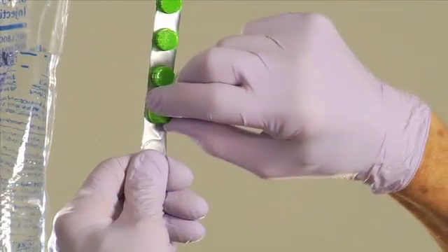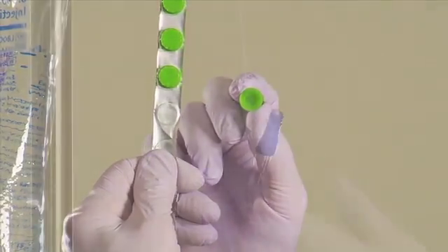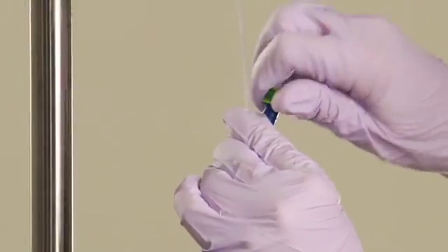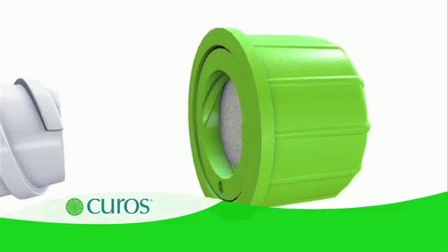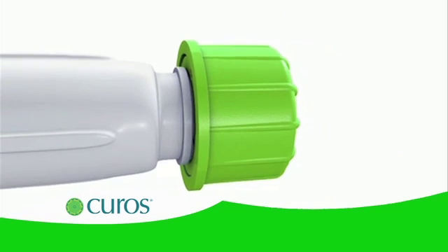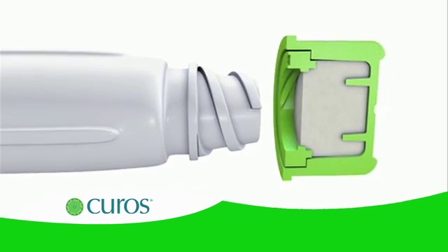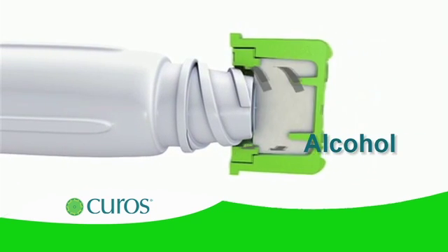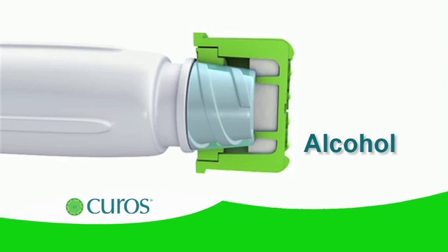To properly use CUROS, simply peel the cap from the foil and gently push and twist it onto the needleless connector. As CUROS is lower locked into place, the disinfecting foam pad scrubs the valve surface. As the foam pad is compressed, alcohol is released, which bathes and disinfects the critical access surface of the needleless connectors, sides and threads.